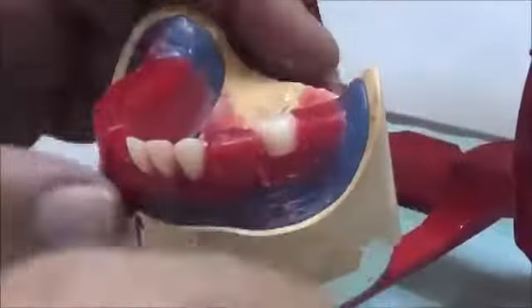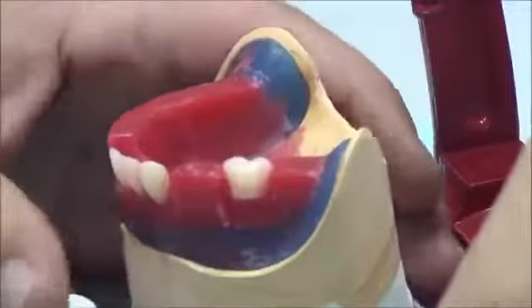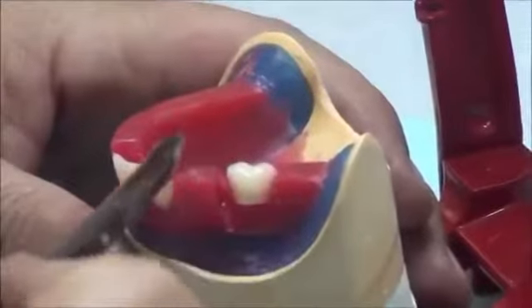After setting from the buccal side, now we're watching the tooth from the lingual side, and what we're trying to do is raise the tooth lingually so its cusps interdigitate and go up towards the palatal cusps of the upper. So that's the lingual interdigitation of tooth number 6. Now that tooth number 6 is finished, we could go either to the back or to the front, meaning that we can set tooth number 4 and 5, or we could set tooth number 7.